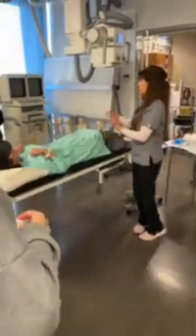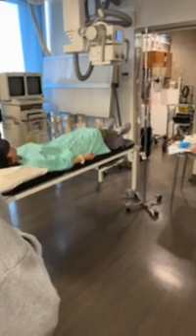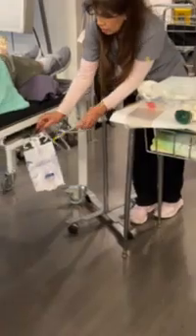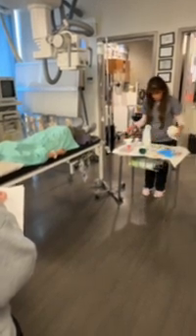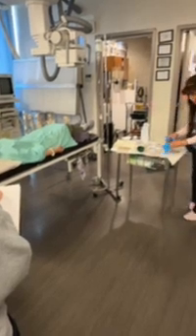The radiologist comes back, and by then I have everything ready here, right? Remember, you should have everything set up. You don't want to be looking for things last minute. This is for the cystogram part if my patient came in with that. So the first part I'm going to do is have everything ready for the radiologist.